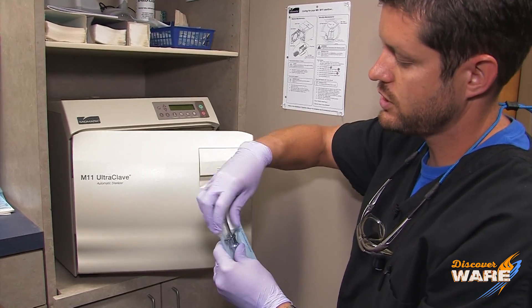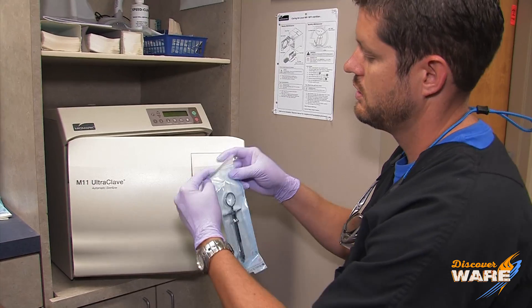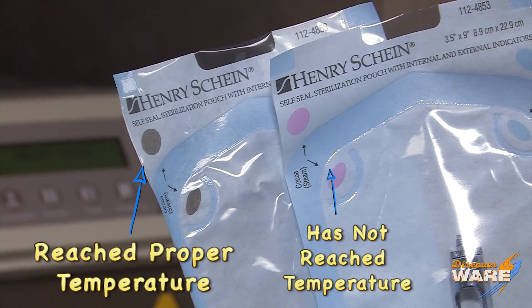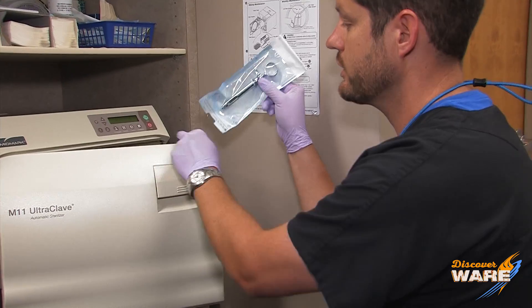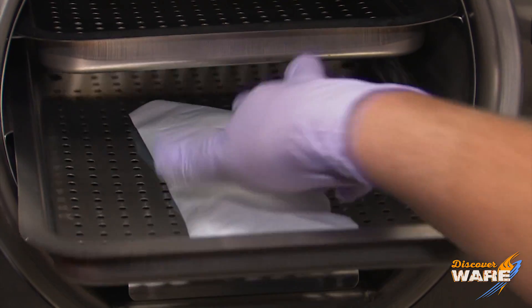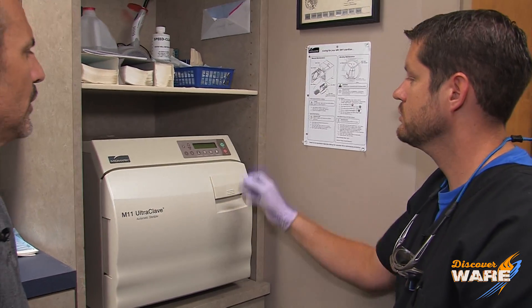Here's our syringe we used on you earlier. What we do is drop that in a pouch — there's a self-seal right here, you seal it — and then it goes in the autoclave. These are the indicators that show that it got to the proper temperature, 270 degrees, and the proper pressure.